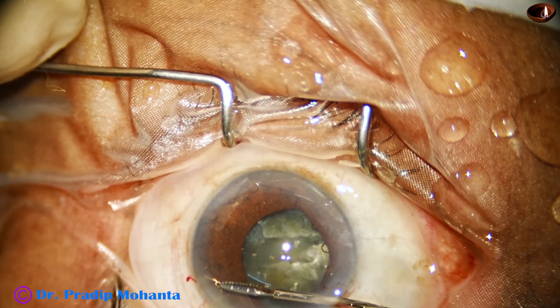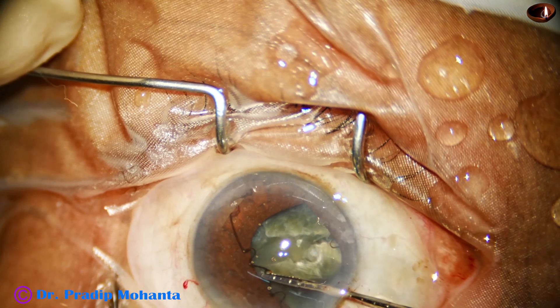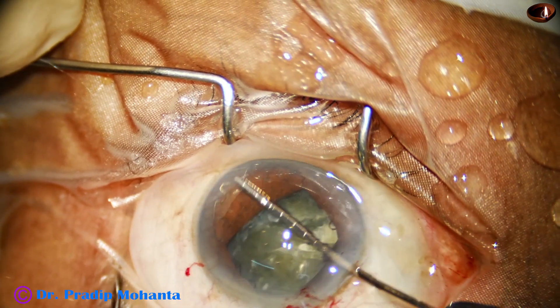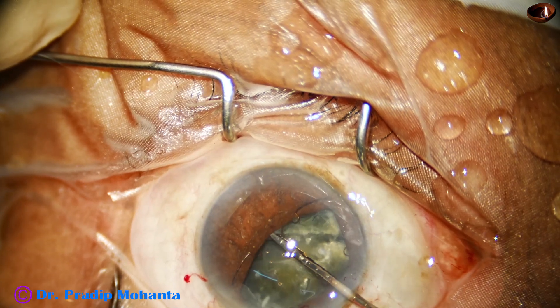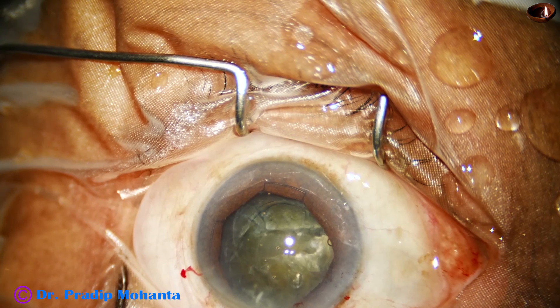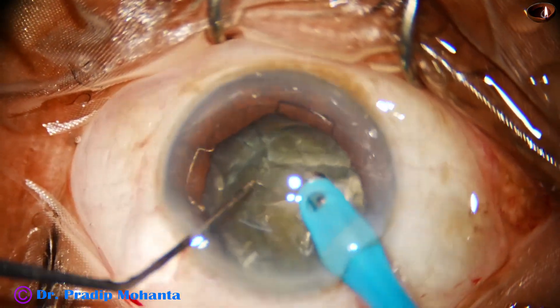See the order. I have tucked the first flange which is in front of the main wound at 11 o'clock, then the 8 o'clock flange, then 2 o'clock, and at the end, 5 o'clock. If we tuck the flanges in this order, then visibility is good for the last flange.